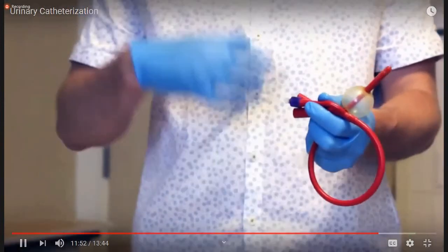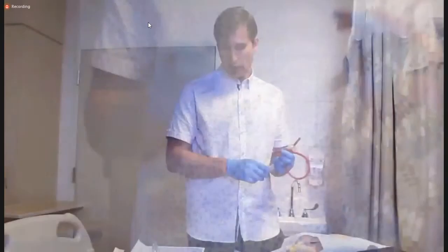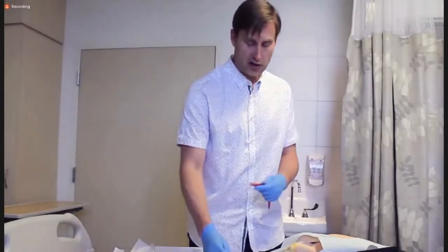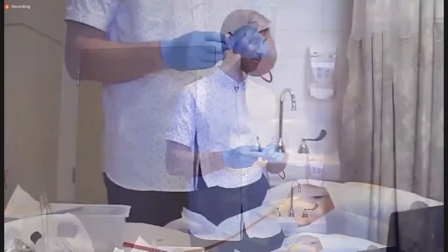But in most cases, you can try to put another catheter in. It'll drain the urine and tamponade any of the bleeding. Another issue that we'll encounter is people will have difficulties placing a catheter after a fairly long distance. So the catheter will go in about halfway down the urethra. In those instances, you should probably suspect a urethral stricture. And then what you could try is smaller catheters. If you're using a 16, maybe try a 14, or even go down to a 12 or 10 French. You might be able to negotiate through that area of narrowing.